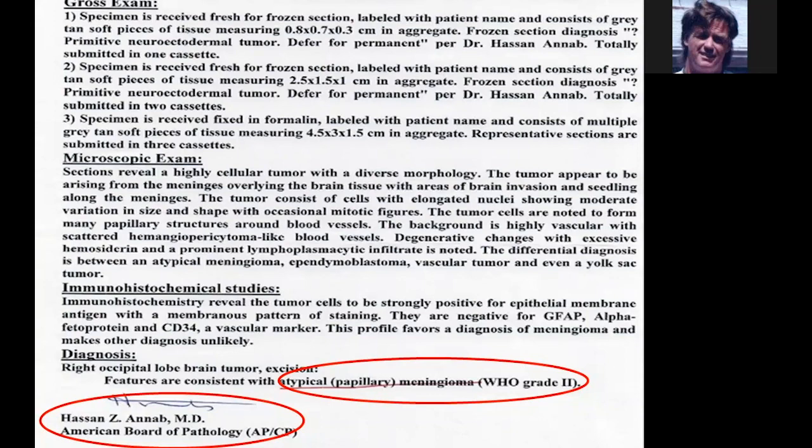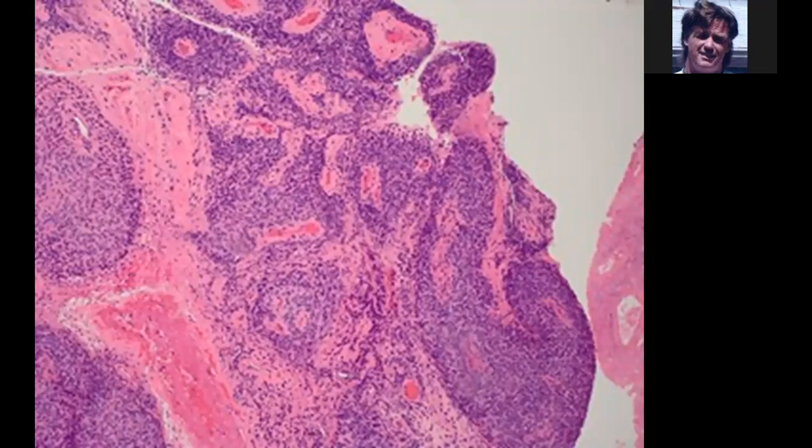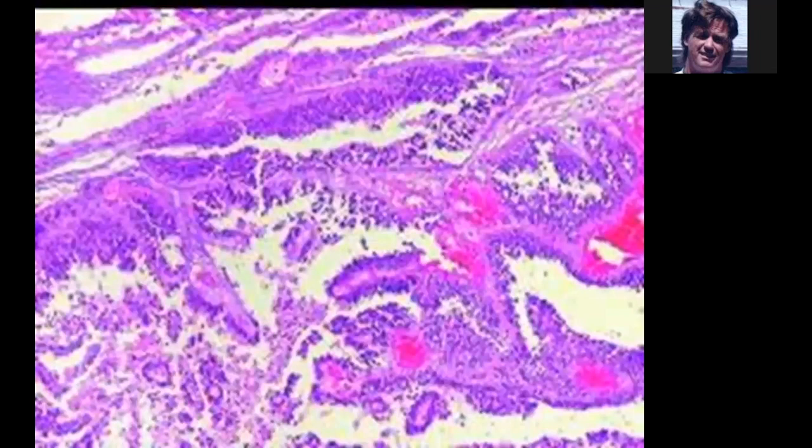Now, this is not from the same case, but I just want to show you, it has a papillary configuration. If you can go to the other view, you can see this is very cellular. And these cells are centered around the blood vessels. Actually, these are not true papillae. They are what we call perivascular pseudopapillae. Probably they take this configuration because the tumor is proliferating rapidly and it exceeds its blood supply. So only the cells around the blood vessels will survive and produce this pattern. And this is also a very prominent pseudopapillae. And you can see that this could be also confused with, for example, choroid plexus tumor, because it is papillary as well.